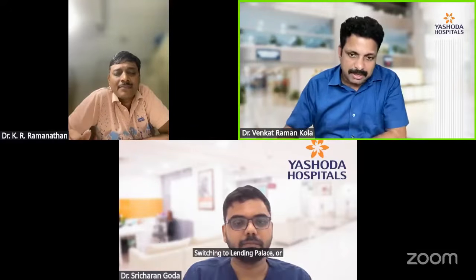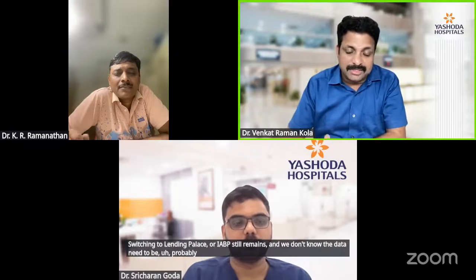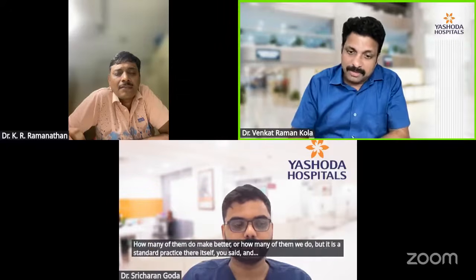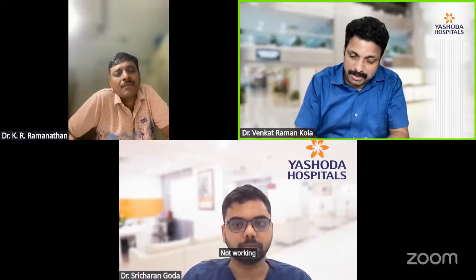So IABP still remains, and we don't know. The data probably need to be reevaluated in Indian scenarios. How many of them do better, or how many of them do we see? But it is a standard practice there itself. You said in LV dysfunction, IABP remains the first choice, and if not working, switch to Impella. That's what you are saying.